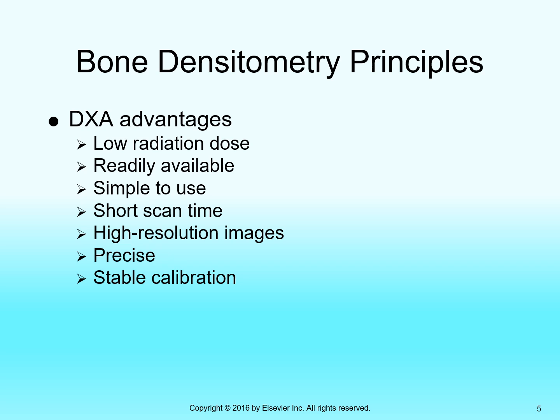They use a conventional X-ray beam, and there are statistical calculations being done in the analysis report, but the software usually does those for the technologist. All the technologist has to do is energize the machine and take the exposures.